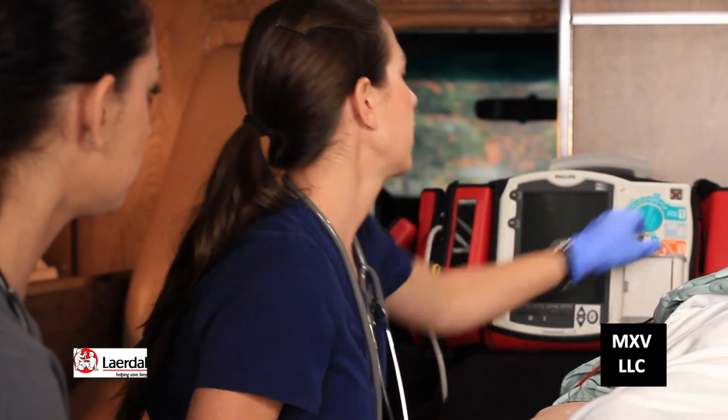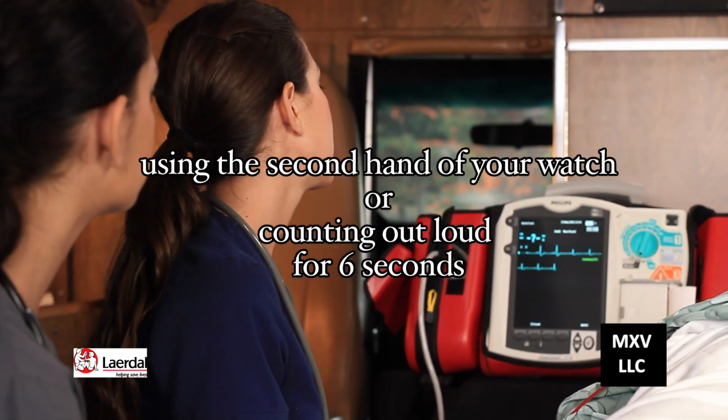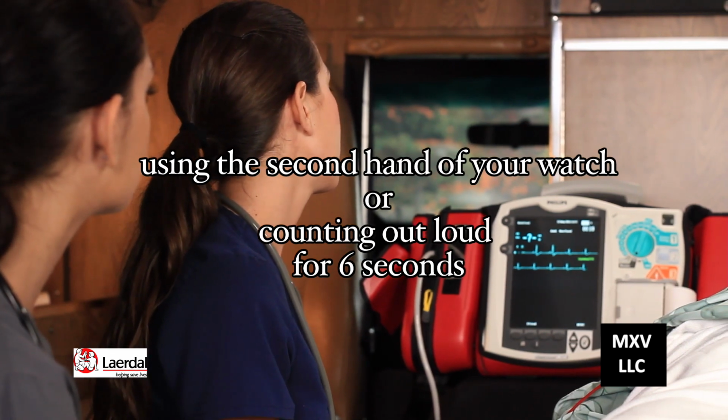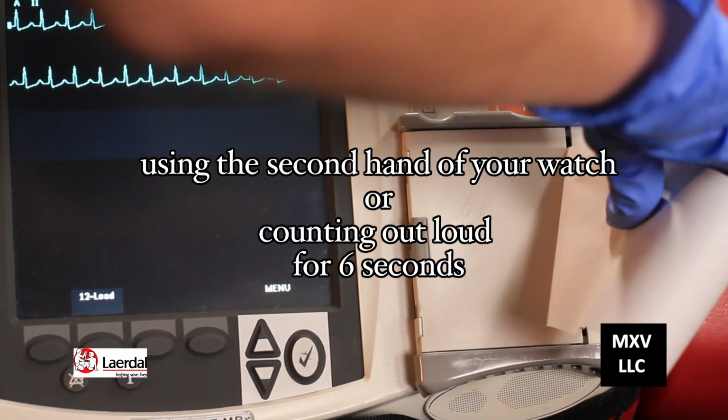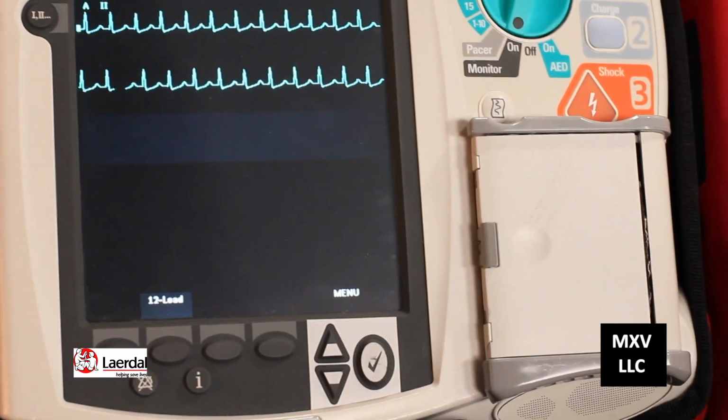Okay, now we're going to run an EKG. Turn on the monitor, and then after we press this button, we're going to count for 6 seconds. Okay. Press it again, and then that'll be our strip. 1, 2, 3, 4, 5, 6. Let's go ahead and take that to your medical record.